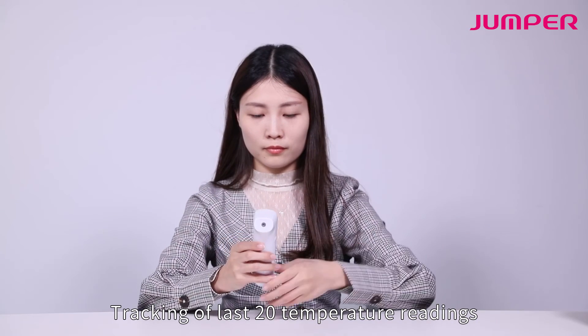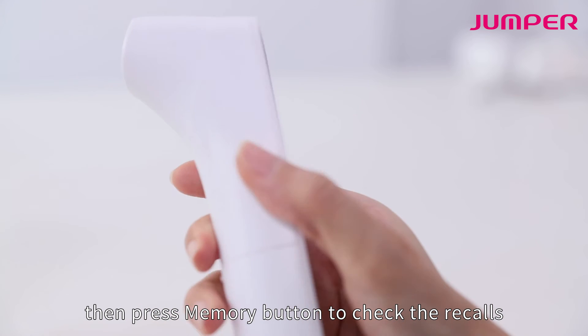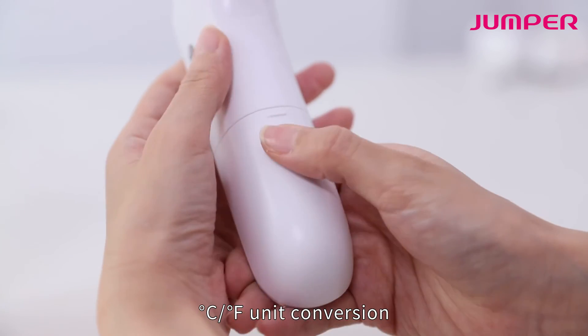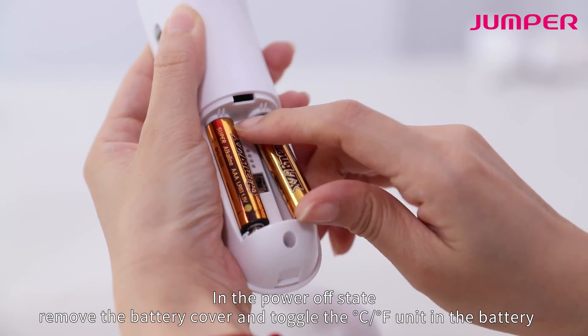The thermometer tracks the latest 20 temperature readings. In the power-on state, press the memory button to enter memory mode, then press the memory button again to check the recalled readings.